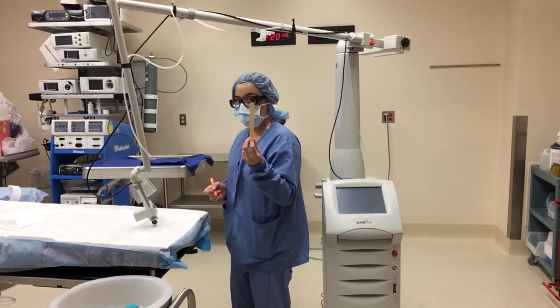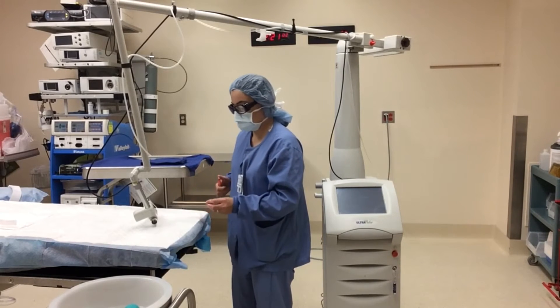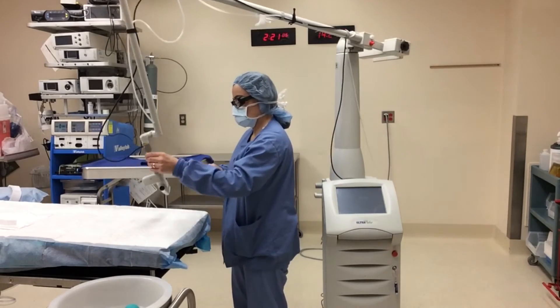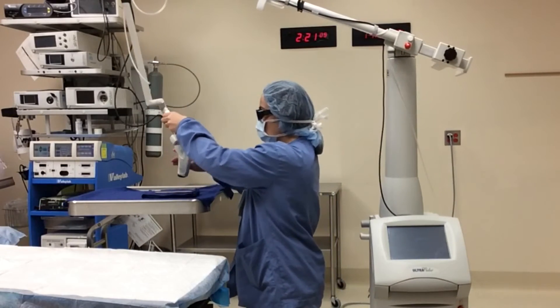We will test the laser beam on a moist tongue depressor. An X marks the spot and will help guide the laser beam. Test fire on an area such as a mayo stand with moist towels.